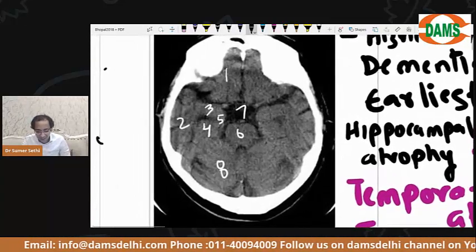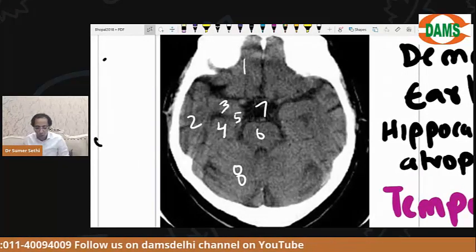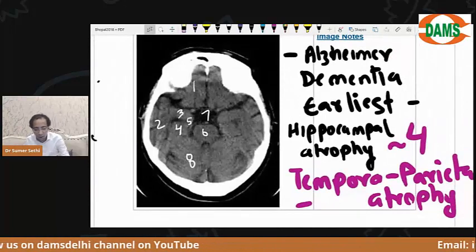Okay, yes. Are you clear? Everybody sees the section now. We are going from below upwards, Rushipita. We're going from below upwards. Yes, everybody understands. Now, let me ask you a question.